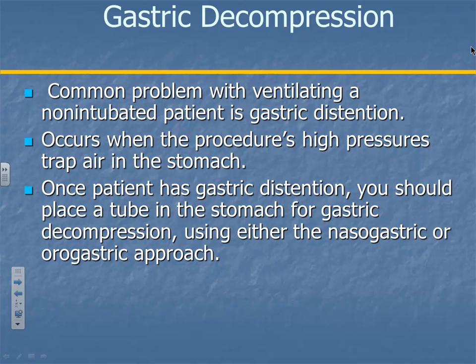If you've got a patient that the people before you were ventilating and they filled the stomach with air. You've done your intubation, you know you're in, but they've got this big old fat stomach inflated with air. You have to get that out, right? Because why? What's the bad side effect of having a big old fat stomach filled with air? They may throw up on you. What else? If they throw up, they may aspirate. It's going to be a big old burp when you're intubated. Oh, that's so nasty. That's really bad.